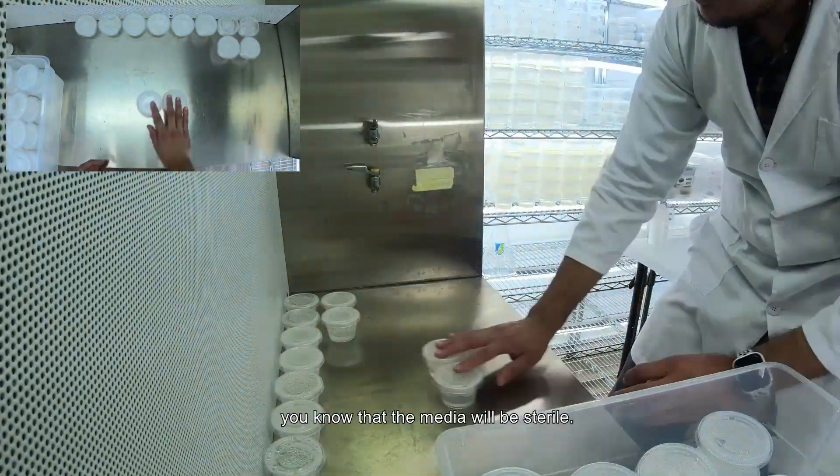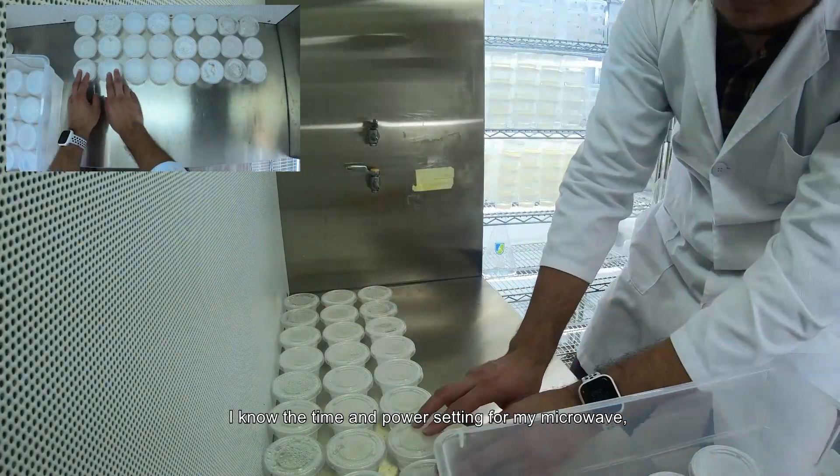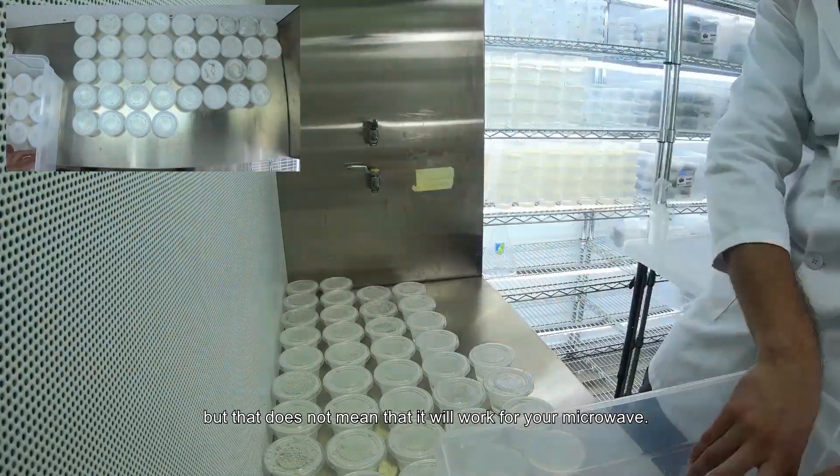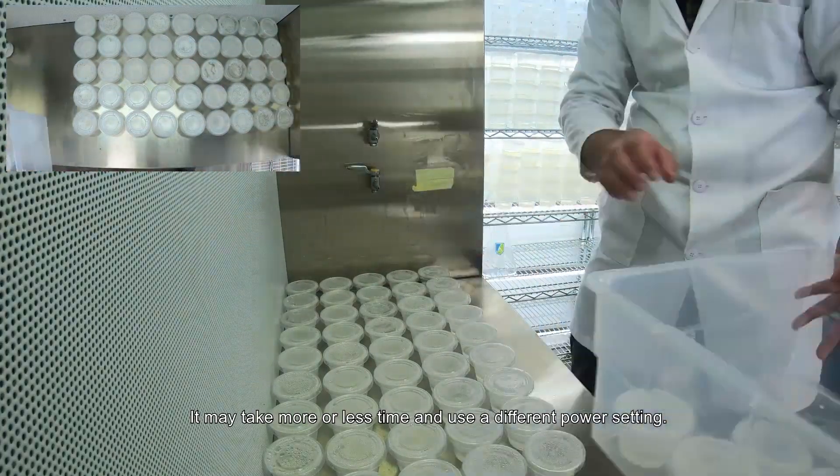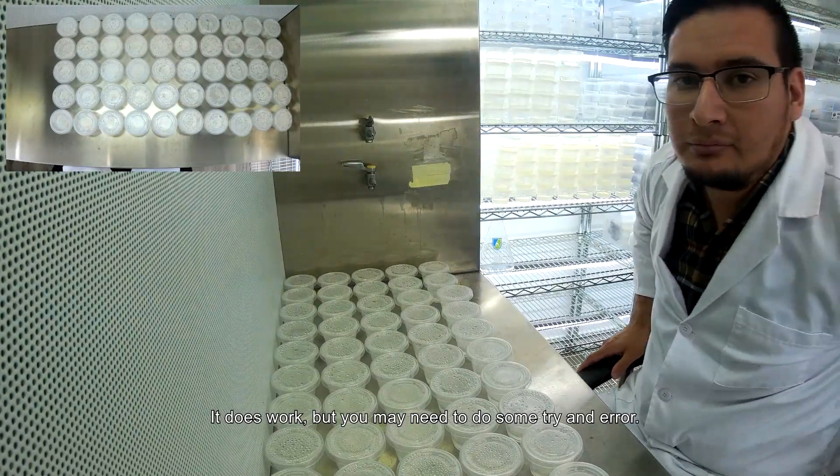I think the pressure cooker is more reliable. As long as the pressure cooker can get to 15 PSI for at least 20 minutes, you know that the media will be sterile. I know the time and power setting for my microwave, but that does not mean that will work for your microwave. It may take more or less time and use a different power setting. It does work, but you may introduce some trial and error.